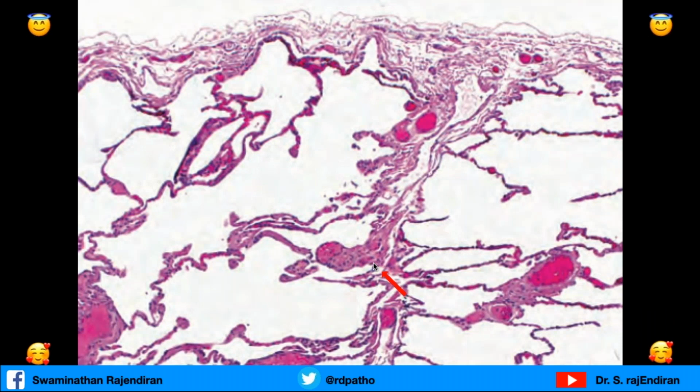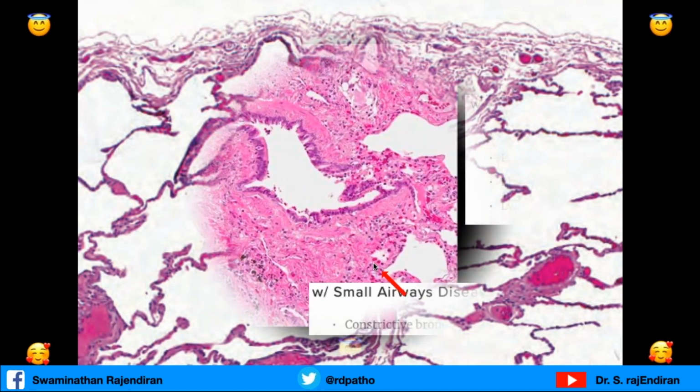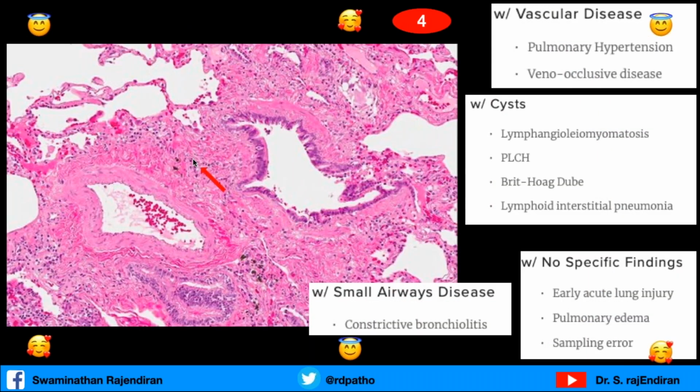Finally, we are seeing the normal pattern, pattern 6, which will be pink and blue. Here, I told you during histology, the airway should be accompanied by the pulmonary artery wherever you go, and the diameter is more or less the same. When you go to the periphery, the airway diameter will become less. Similarly, the arterial diameter will also become less. So this is like husband and wife.